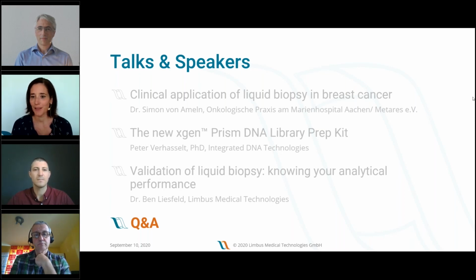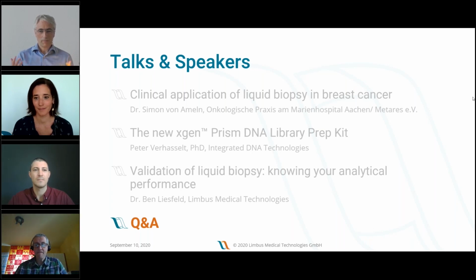Next question. Can I use an NGS panel of 600 kb for liquid biopsy? Who wants to take this question, Ben? Well, from a technical or bioinformatics point of view, to some degree the size is irrelevant from a data processing point of view. But of course, it impacts the cost factor.